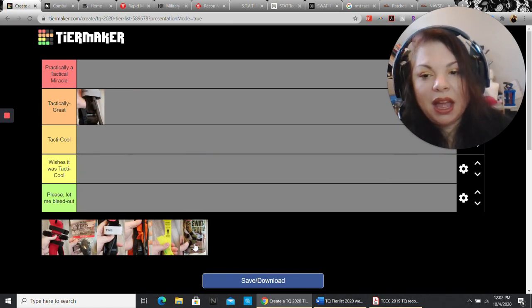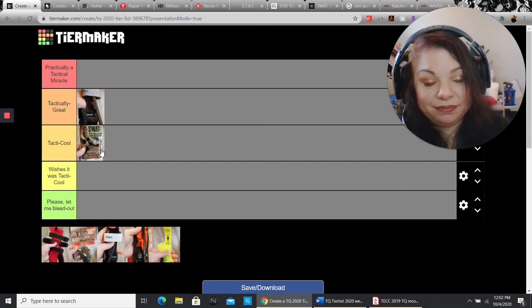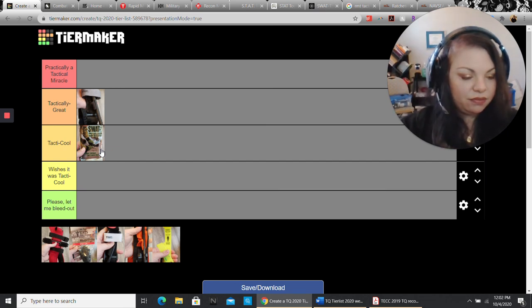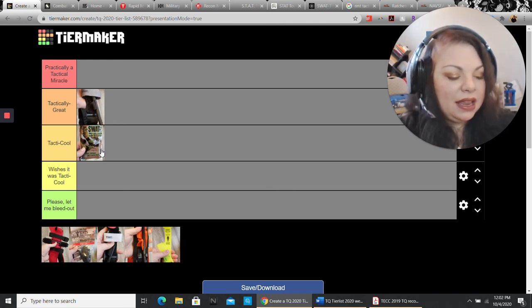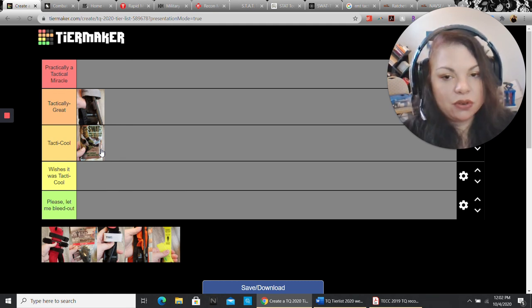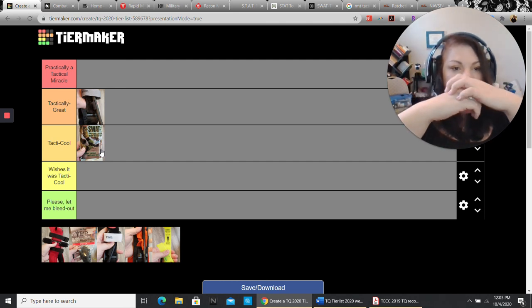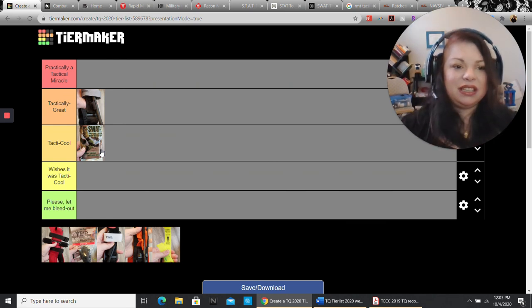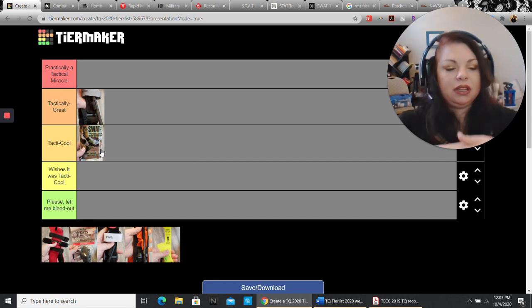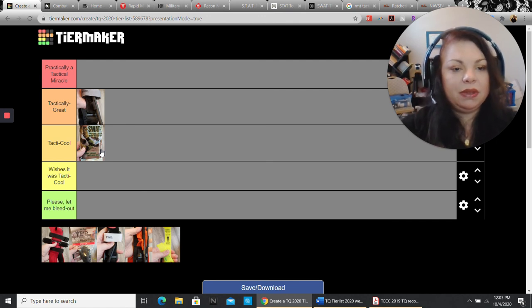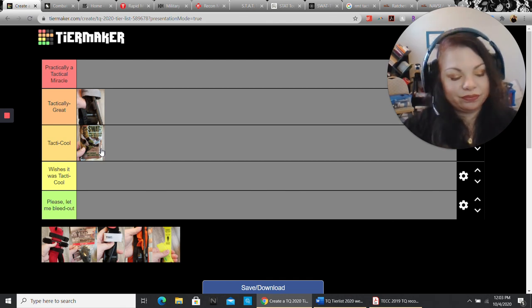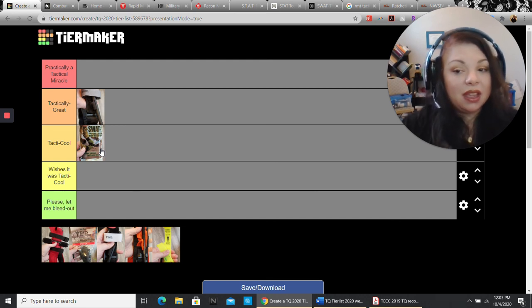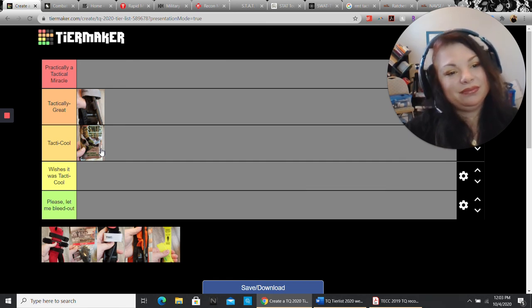However, I'm sticking this one here into my tactical. And here's why. It is not as effective, in my opinion, as a windlass tourniquet. It's very slow to apply. If you try to apply a SWAT T very quickly, instead of the band lying mostly flat, it's going to start to curl up and you're going to get indents. Those indentations are exceptionally painful. When you indent over a wound, you get blistering and other problems. Very good for affordability, mostly effective, but ease of use, application speed, not my favorites.